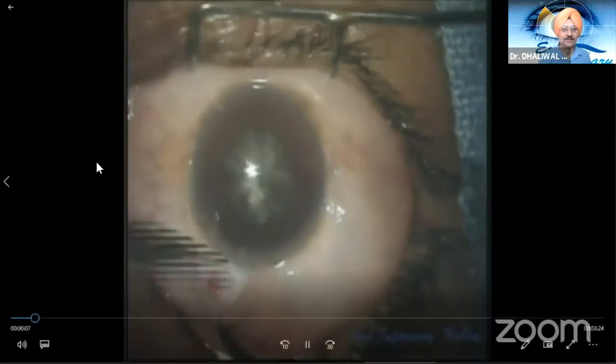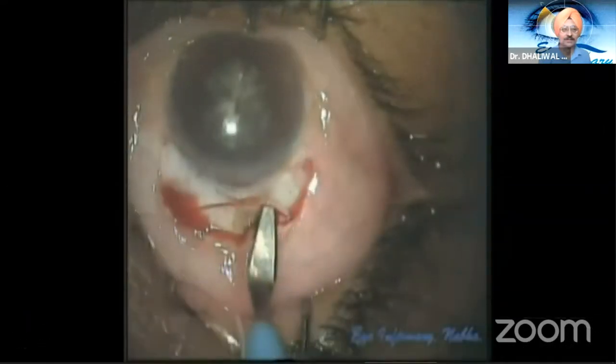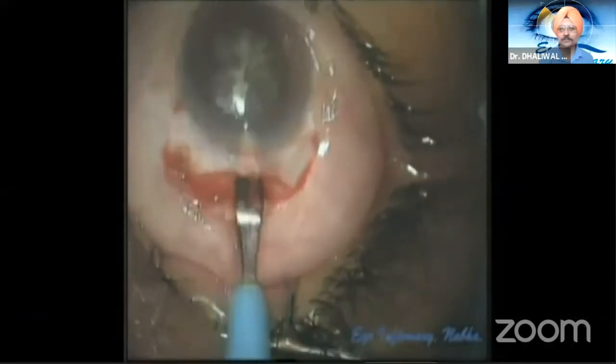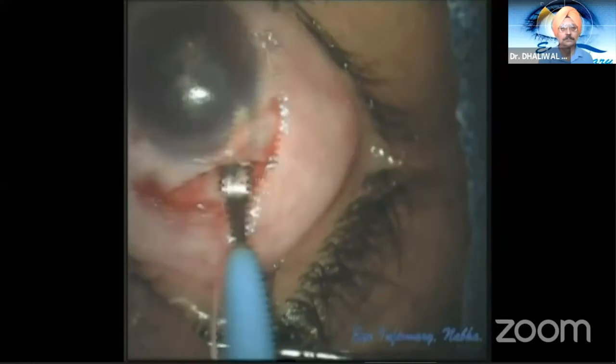Hi everyone. In this video, we are dealing with a rock-hard black cataract and a ready-to-constrict pupil. Both these conditions are a nightmare for any cataract surgeon, particularly phaco surgeons. Other than the masters, such cataracts are always accompanied with lax zonules.